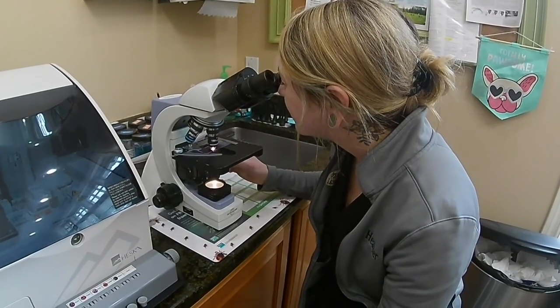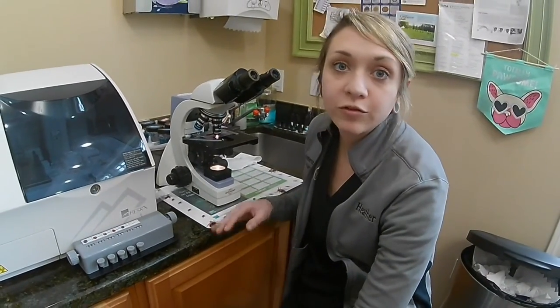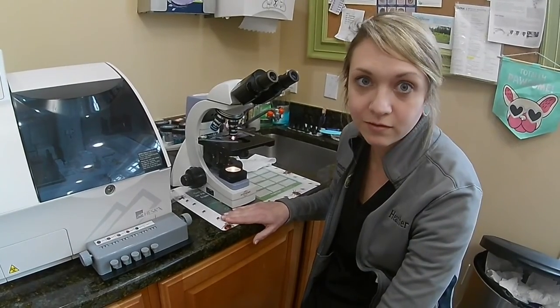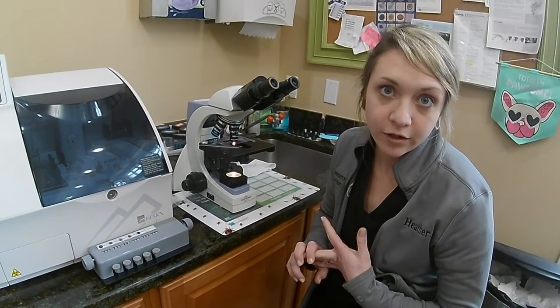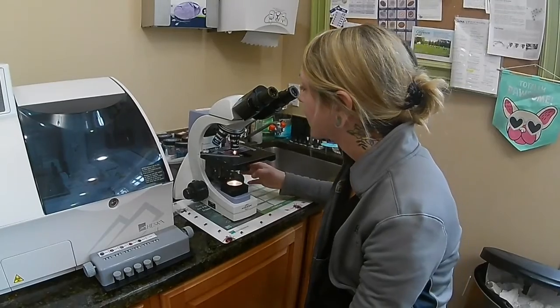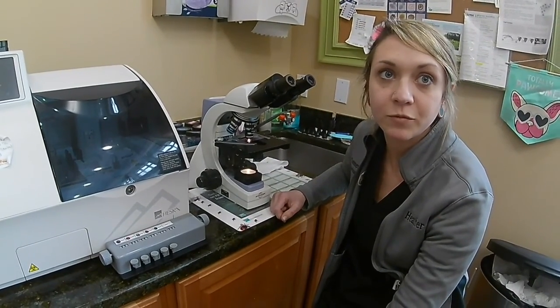So for the platelets, to count those, I'm going to be doing 10 different fields. You're going to count the total number for each field, and then multiply that number by 20,000, and that's going to give me my number of platelets for the sample. And then in regards to the erythrocytes, or the red blood cells, we're going to just be paying attention to size, shape, and color. Those are the things we would document. We don't necessarily count all of the red blood cells. That's what we would be doing with the PCV, actually. So this is the basics for doing the manual CBC. We'll move on.